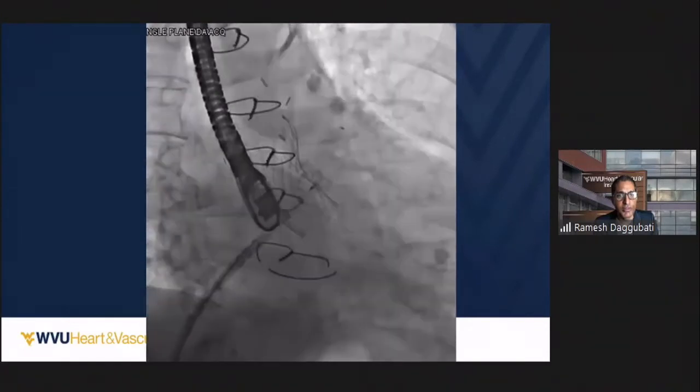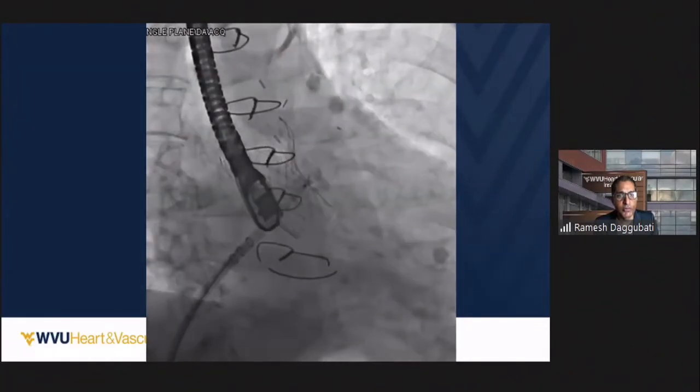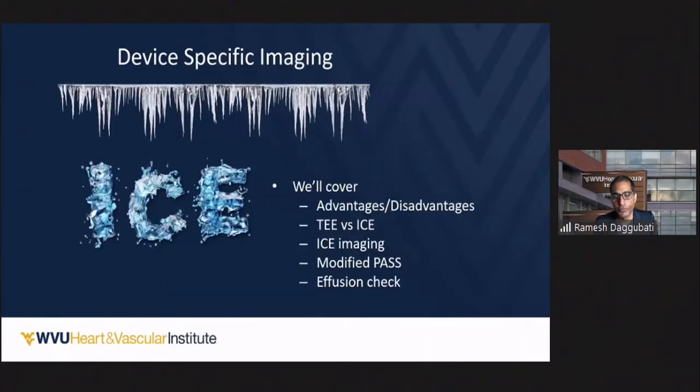And so then we did the tug test, and we let it go. It was very quick and easy once we were able to do the transseptal puncture. That actually took 2 hours, and 15 minutes was the WATCHMAN deployment.